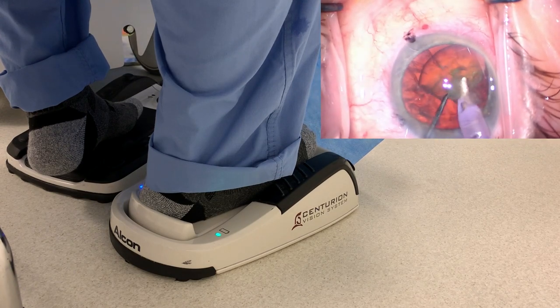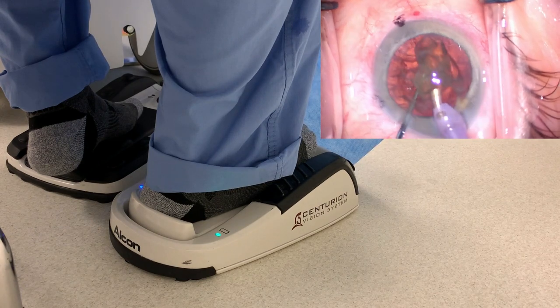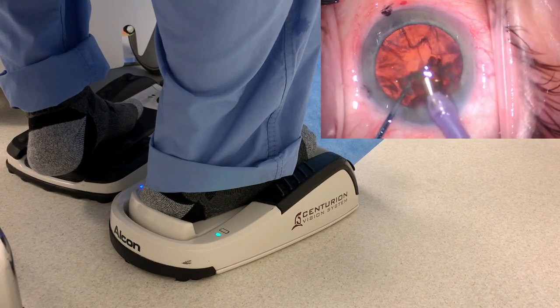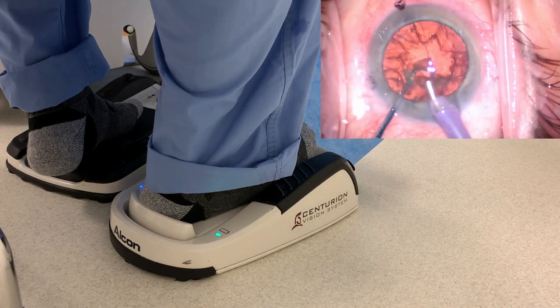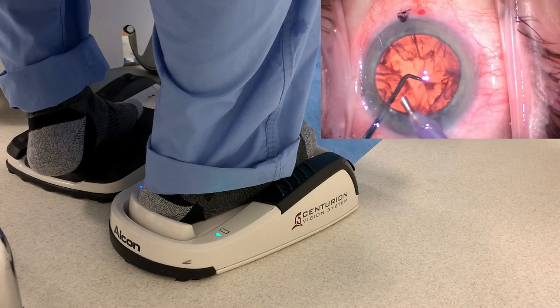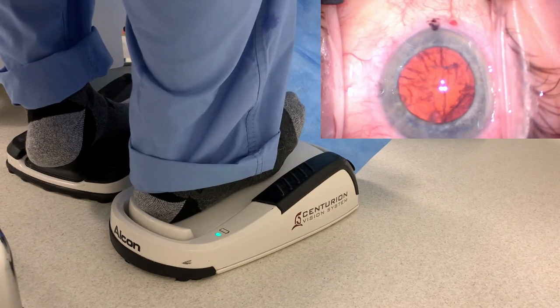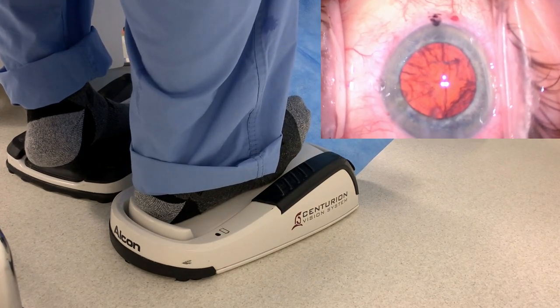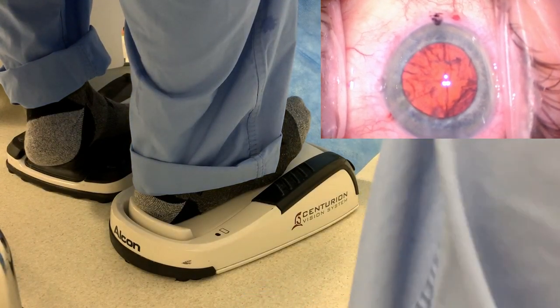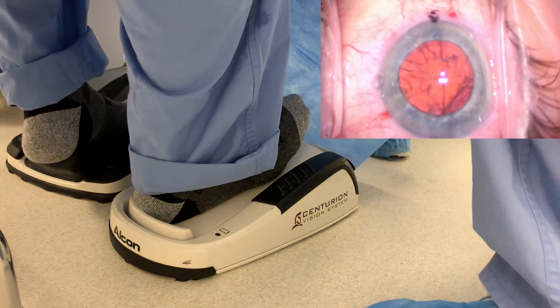I know we focused on the pedals here, but it's really not a lot of action seen there. With the chopper in the safe position and advancing, more phaco energy going in the eye. Now watch my foot carefully as I come out of the eye — go to position one. Let's get that last piece of nucleus. Come out, and now look at my right foot. You notice how I tap that button? For me, that's changing it to the next mode, which is irrigation-aspiration to remove lens cortex. We tap that pedal twice to move over to the next mode.